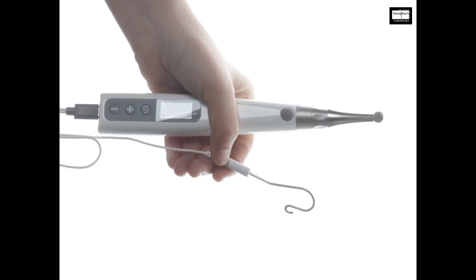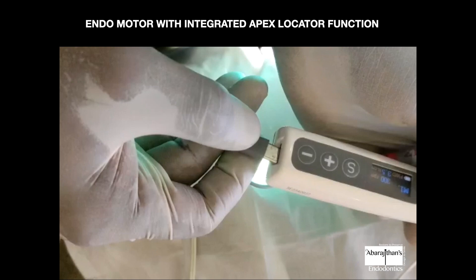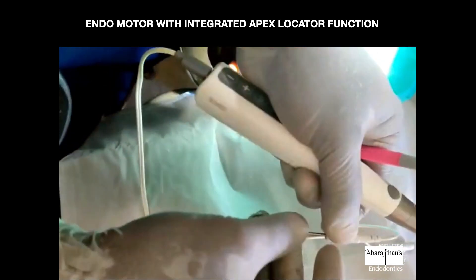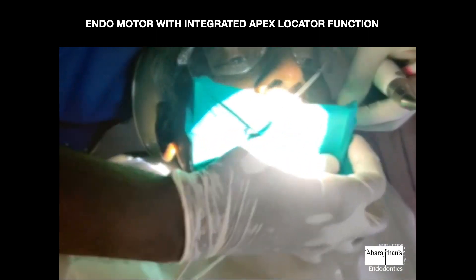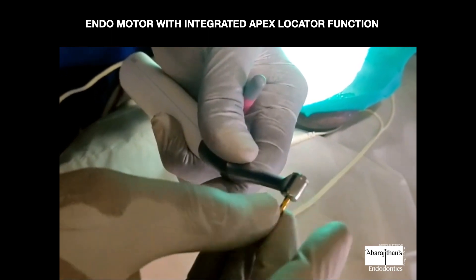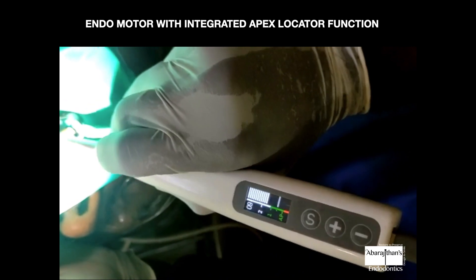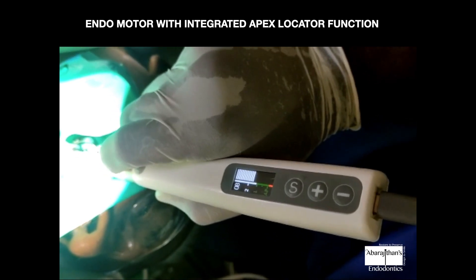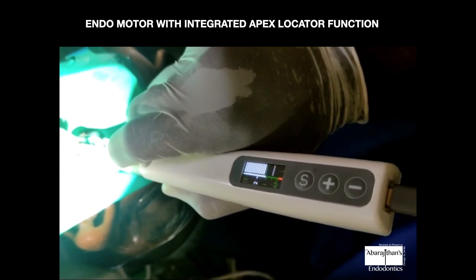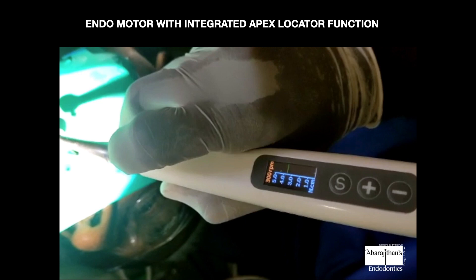What does this integrated apex locator function really mean? With these kinds of endomotors you don't need the lip clip as a separate step at all — you just attach the lip clip to your endomotor and place it in the patient's mouth, then attach the rotary file you are going to work with. When you start working, the apex locator is functioning in real time. With both the visual display and the sounds the apex locator gives you, you are in control of your working length throughout. This is a dynamic working length determination method, compared to the static way of determining working length once and sticking to it.